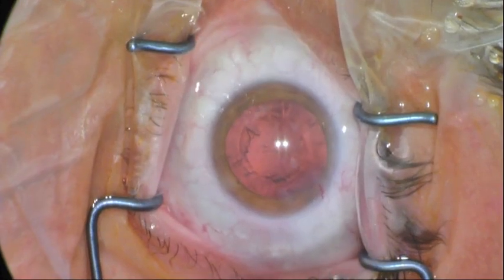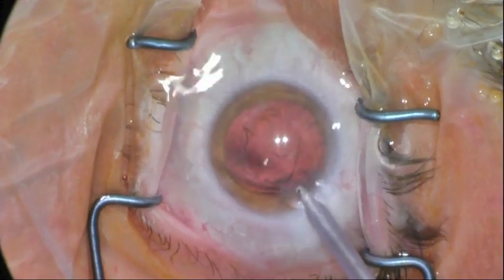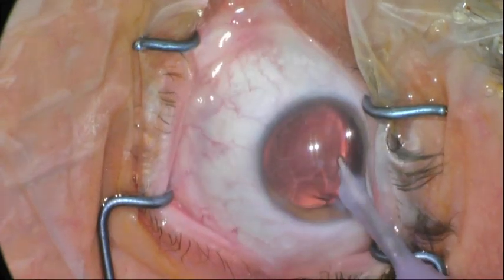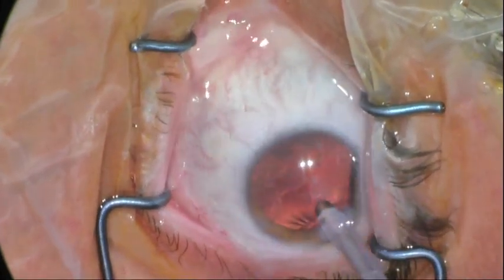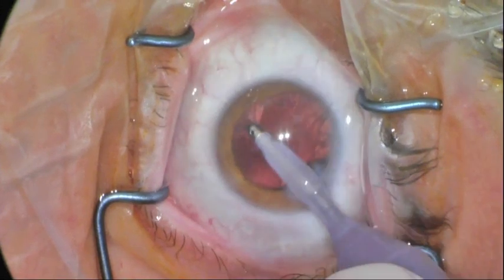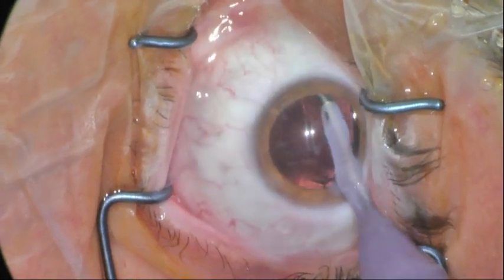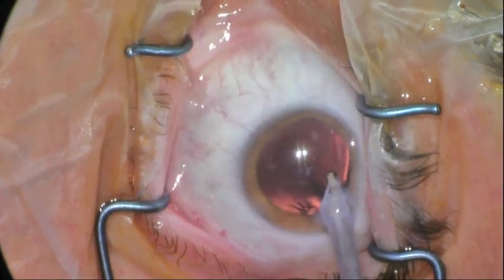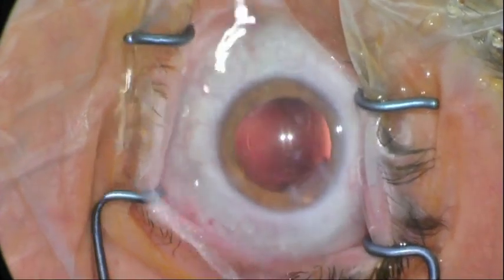So the score and bloom technique converts the energy of hydrodissection into effectively a cracking technique where the energy is transmitted into the lens instead of towards the posterior capsule. And here we have an intact posterior capsule. And we proceed then with lens insertion.